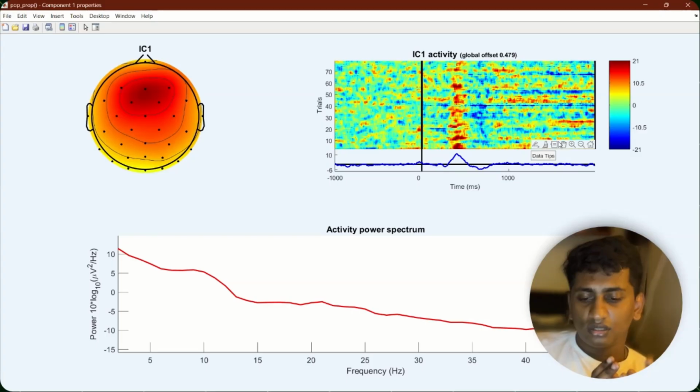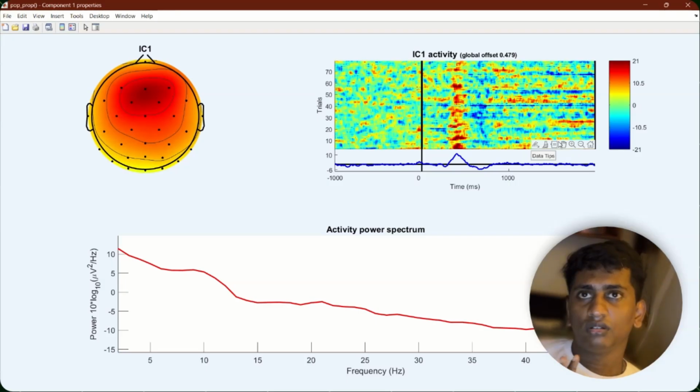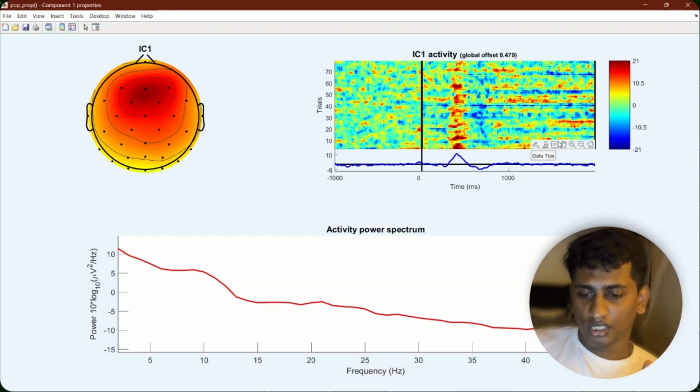To convert this image for CV pipelines, you can export it to a topomap as a grayscale 2D image on a fixed spherical grid, for example 32 by 32 or 64 by 64, and normalize the values to zeros and ones, and keep the same interpolation grid for all trials. Consistency is essential in this. People at an advanced level will use CNN or machine learning models, so you'll get an idea.